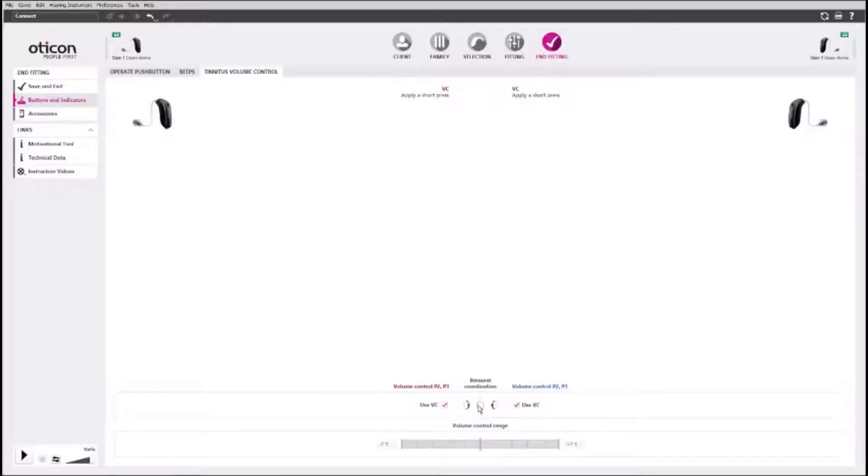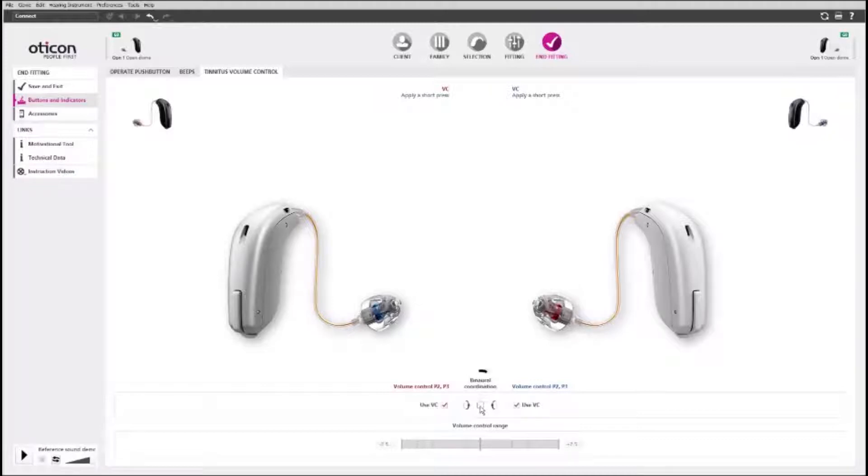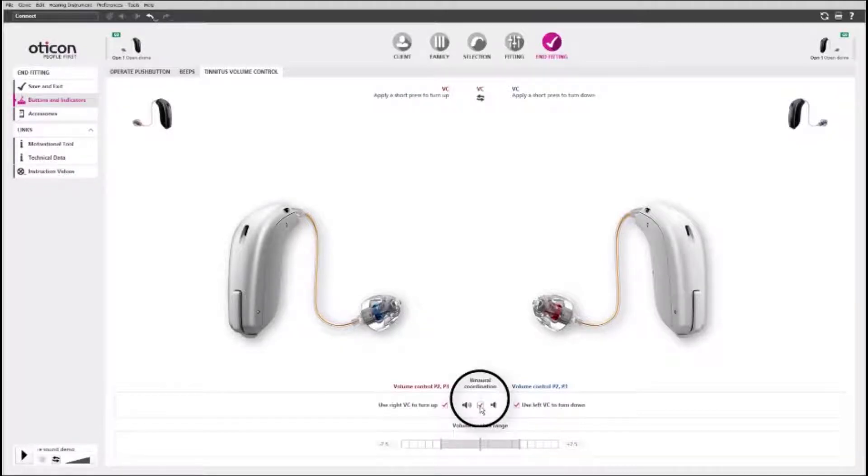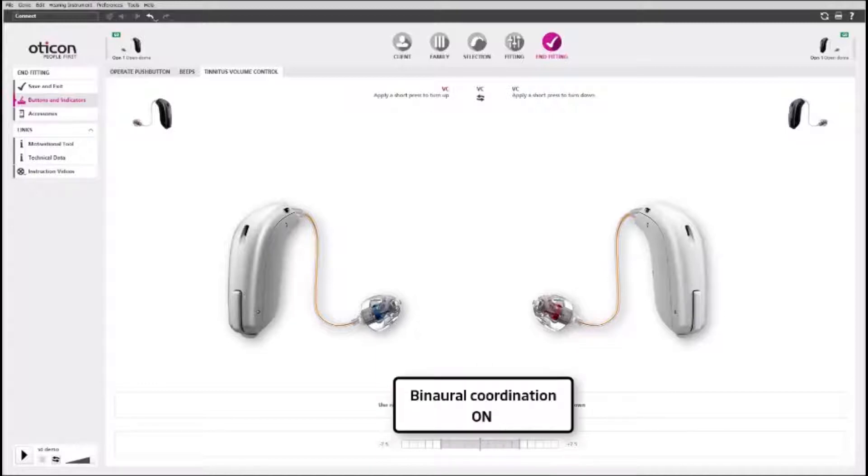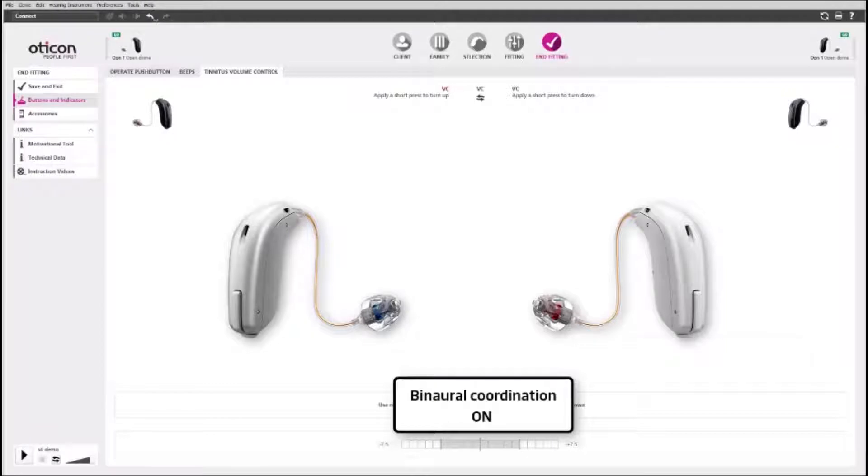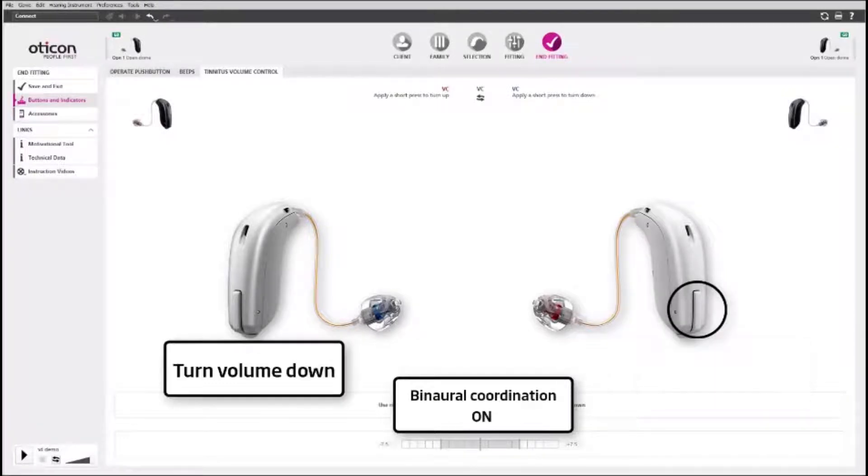If you are fitting a Mini-Rite hearing aid, the single push button can have two modes. With binaural coordination on, pressing the push button adjusts the tinnitus relief sound volume of both hearing aids. Pressing the button on the right side turns the volume up, and pressing the button on the left side turns the volume down.